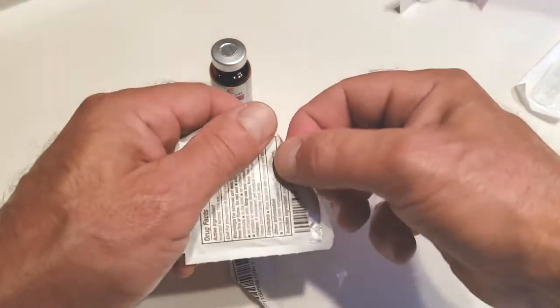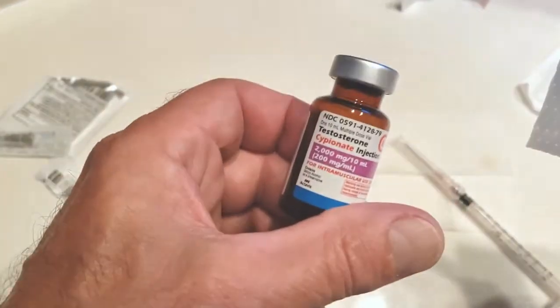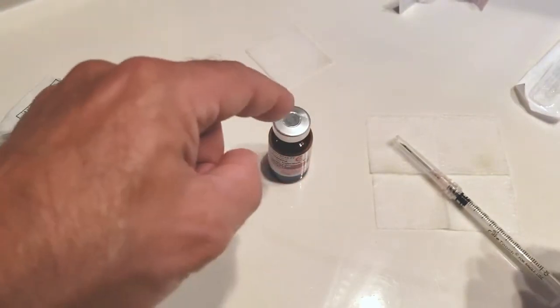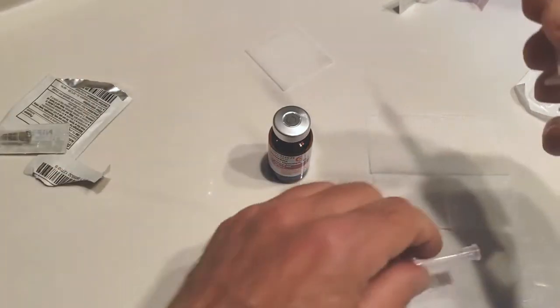I open up an alcohol pad and clean the top of the diaphragm of the testosterone cypionate bottle. Once the vial is clear, I can set it back down. Nothing that is non-sterile will touch that. I take the cap off of the 18-gauge needle.